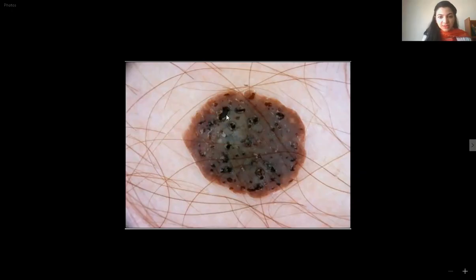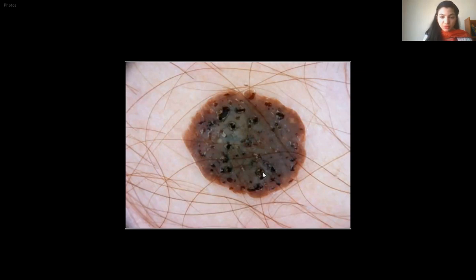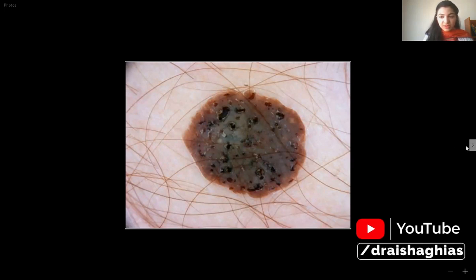This was our first image. As you can see, the image is very well circumscribed. It has got a dark brown color in the background; however, on the top of the lesion and distributed throughout are these black comedo-like openings. These are the typical comedones or comedo-like openings that we see in seborrheic keratosis, and most of you were right about the diagnosis. This is seborrheic keratosis. As I told you, it has many varieties and dermoscopic features, and maybe in the coming images we'll discuss them.